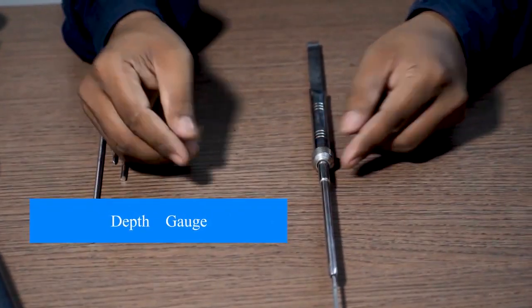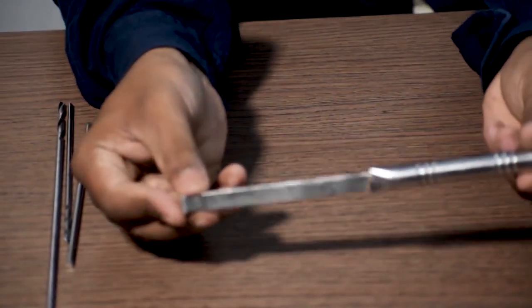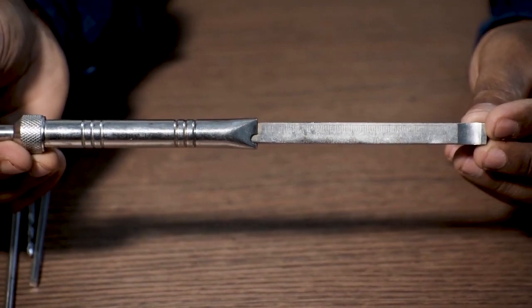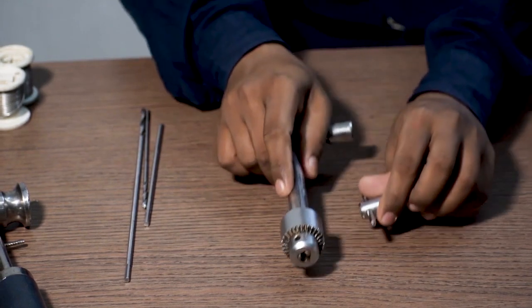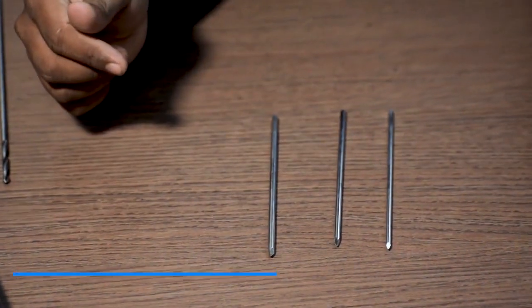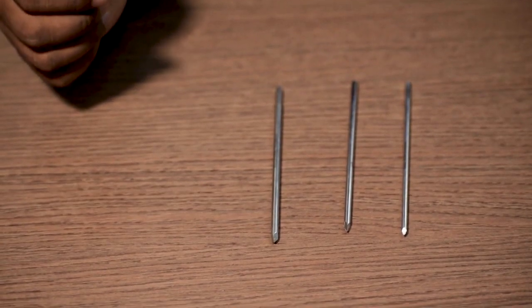This is called an extractor rod, and this is a sliding hammer. Then we will require a depth gauge. This is called a hammering adapter. This is called a T-handle with chock and key. This is a stainless steel pin in 3 mm, 3.5 mm, and 4 mm sizes, 6 inches in length, 2 pieces each.